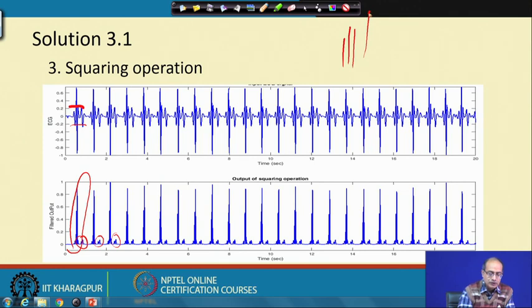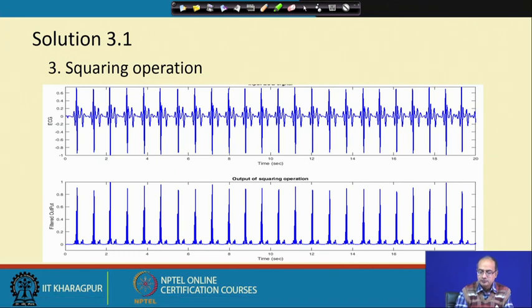Okay. So, multiple peaks will make it difficult to detect. Instead of one, we will get multiple values above the threshold. So, then it would be a challenge to find out the location of the R wave, because we know here only one R peak is there. So, we need to take care of that situation.